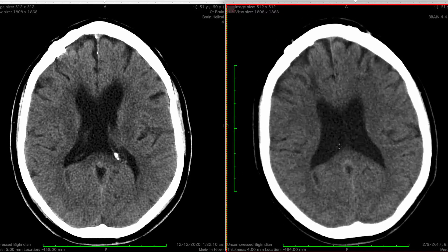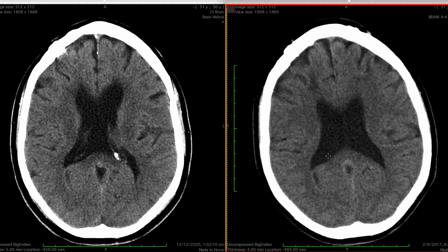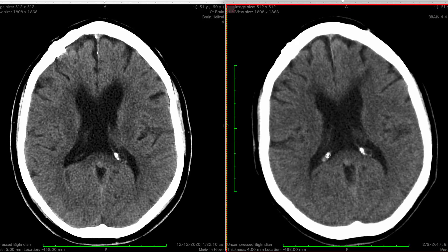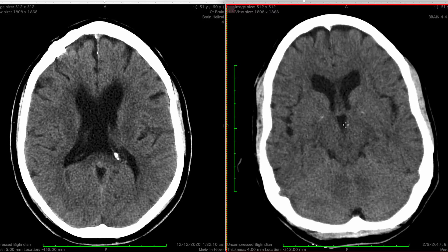You can see that there are further paired high-density structures in the lateral ventricles. These are calcified choroid plexi. These structures are there to produce CSF, which then collects into the lateral ventricles and drains into the third ventricle via the foramen of Monroe, which is in close proximity to the colloid cyst. You can see how this cyst has the potential to cause issues with CSF drainage in this region.